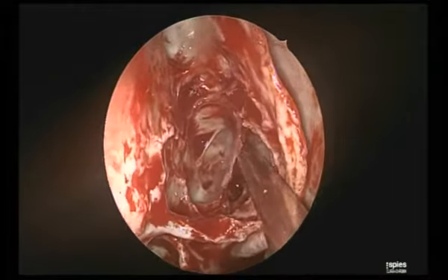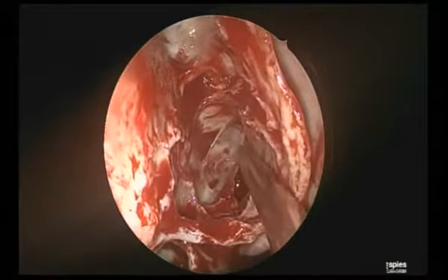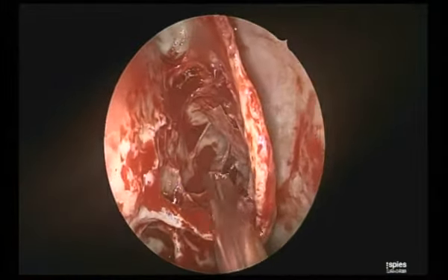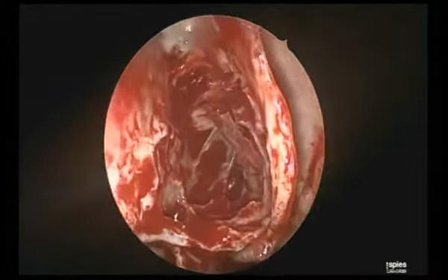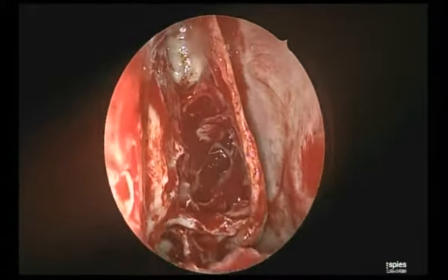Immediately, forget about Onodi or anything, you can never damage the nerve. This is the simplest philosophy, and this is what we are giving our students in the hands-on surgical courses, to follow this.